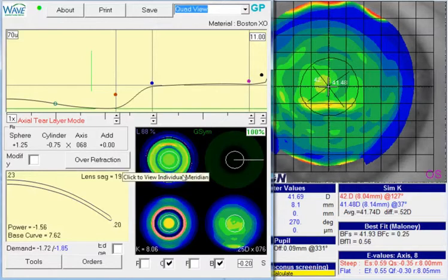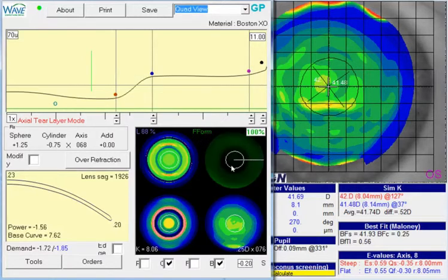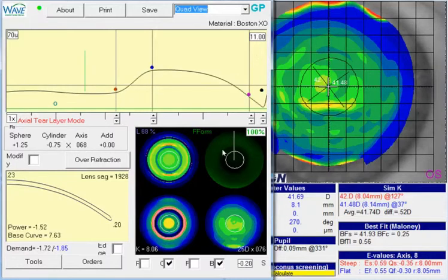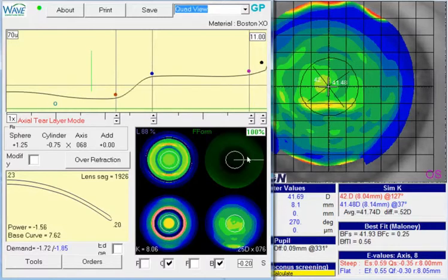Another thing is in preform mode, we can see that especially superiorly, we're not getting very good clearance at the back edge of the optic zone. Although I think if we increase the demand, that'll improve a little bit.